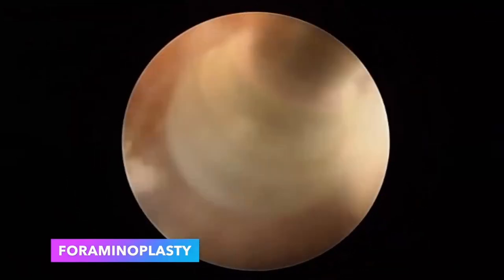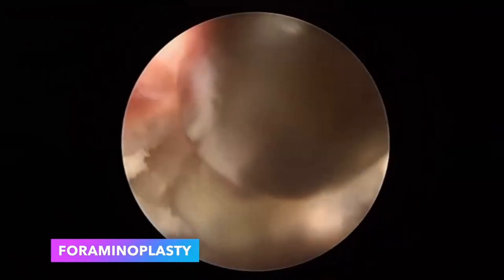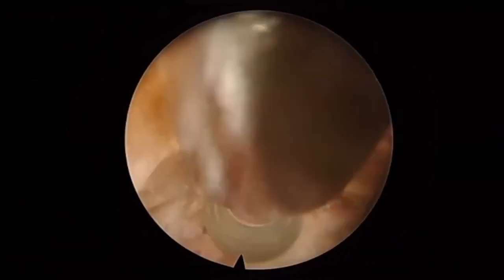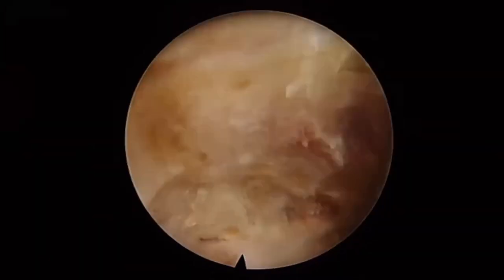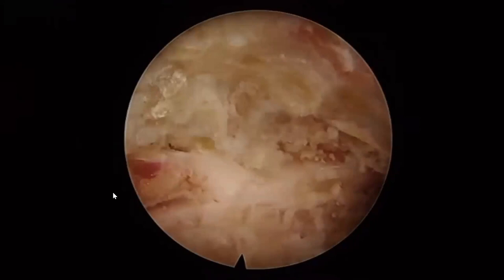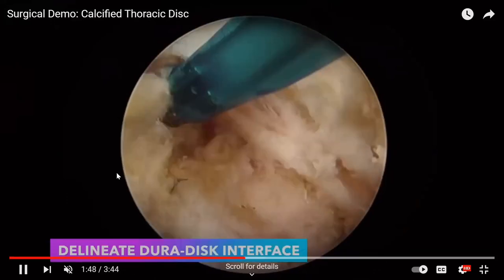It just depends on what pathology you're looking for. Sometimes just reaming gets you what you need, but most of the time, I'd say, you want to drill further on the SAP and on the pedicle. You also want to drill into the vertebral body, especially if the disc is calcified. Just like with open surgery, you create a little pocket or window underneath the disc, and then you flick the disc down into the cavity that you created. Fast forwarding here, now you start seeing the dura there.